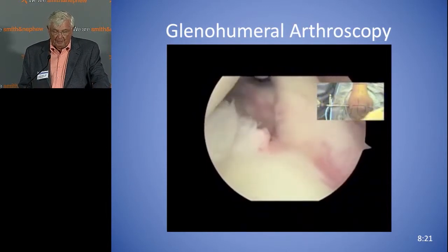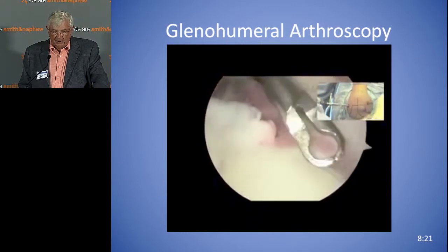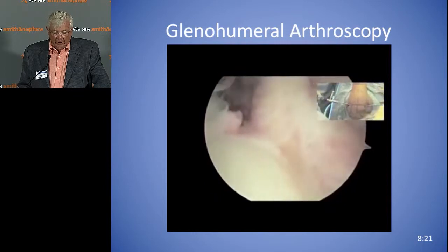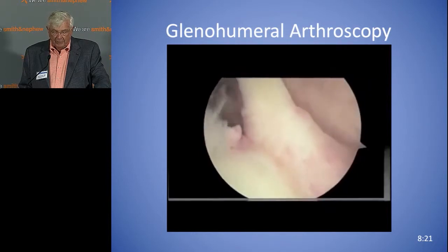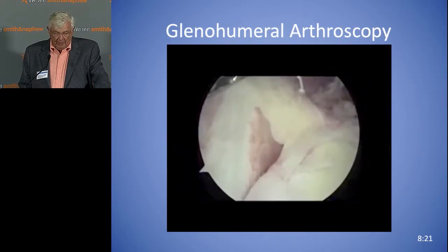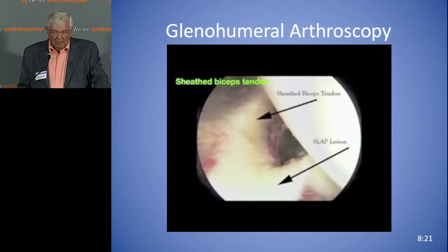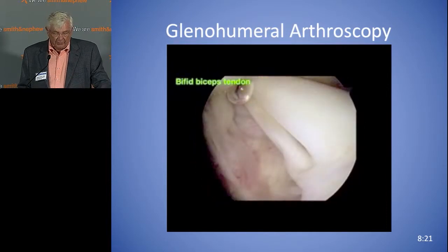Now we're backing up. You can see the biceps anchor — we're going to hear more about the SLAPs. There's a lot of variation in the superior labrum. And in terms of the biceps tendon, here you can have a split biceps. So there is abnormality and pathology. Sometimes the biceps is in a sheath that you can't actually see, and there are various degrees of that sheath. Or you can have a bifid biceps tendon.